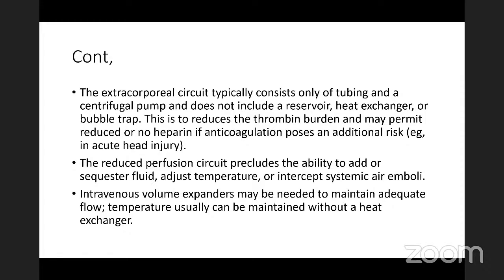Intravenous volume expanders may be needed to maintain adequate flow. Temperature usually can be maintained without a heat exchanger. As I mentioned, only the centrifugal pump is what we are going to use. Please, if there is any question or any comments, you can stop me at any point.